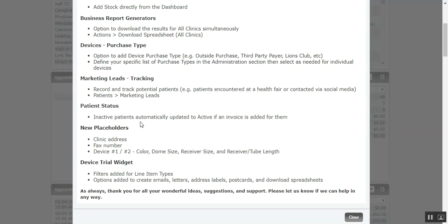Looking forward here, there are new placeholders for clinic address, fax number, as well as several for specifically for devices related to color, dome size, receiver size, tubing, and receiver and tube length.